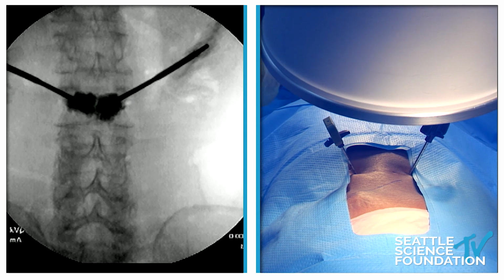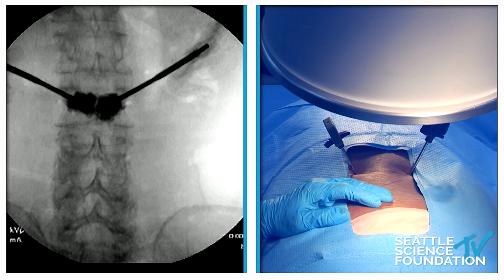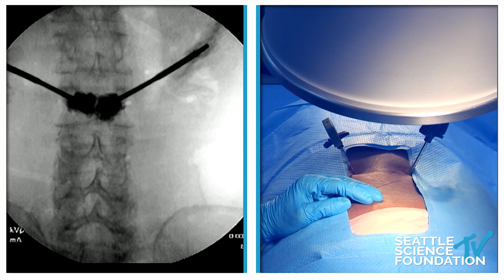So the cure time is usually 10 to 15 minutes, but you can accelerate that by adding the sterile water, hot water, dipping the reservoir in it. But you just have to be careful that when you accelerate, it may end up hardening in your insertion device, but you'll learn how to do that as time goes on. And we'll need all the tips and tricks we can, especially for very fragmented vertebral fractures and tumor-involved vertebral fractures.